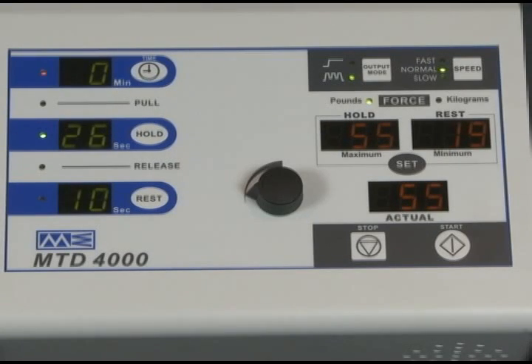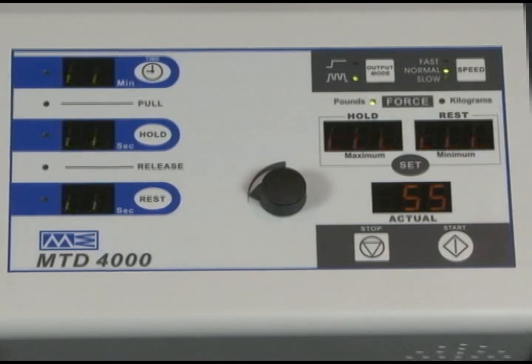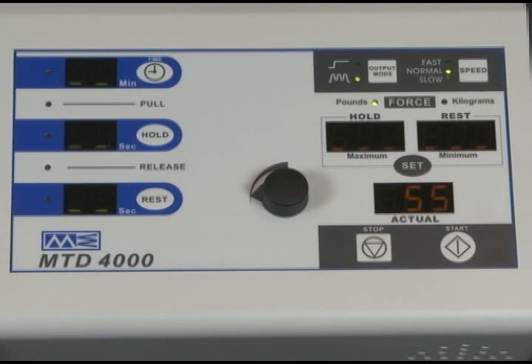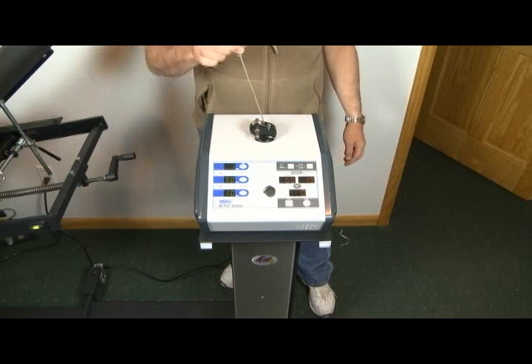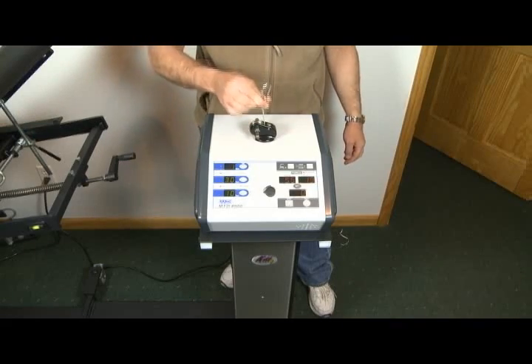At the end of the time treatment, the time LED will flash and the unit will cycle itself off and display the parameters of the treatment again. Unclip the cable from the pelvic belt or cervical device and allow it to slowly retract. Do not try to force the cable back too quickly or it could cause slack in the cable and cause a malfunction to occur.